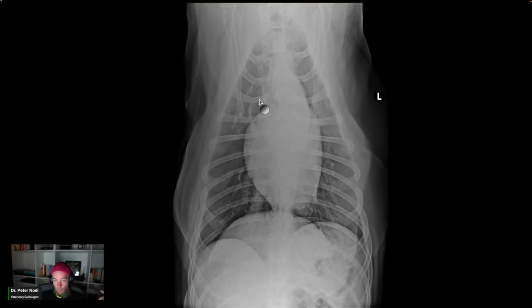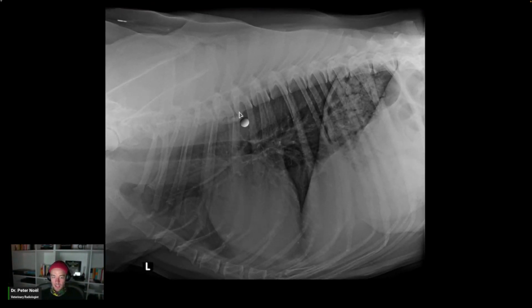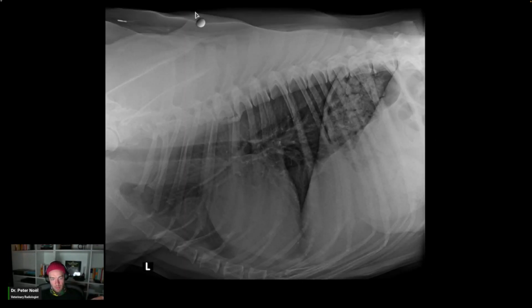But I also don't really see it here, and I don't really see it in the lung, and I don't really see it here, and I don't really see it there. Excuse me. So it's there. And so that has to be in a midline position. And we don't see it because there's a ton of fat that it's going through. This beam is just coming all the way through. It's attenuated. It's probably being partially obscured by the cardiac silhouette. So I'm not surprised we can't see it.